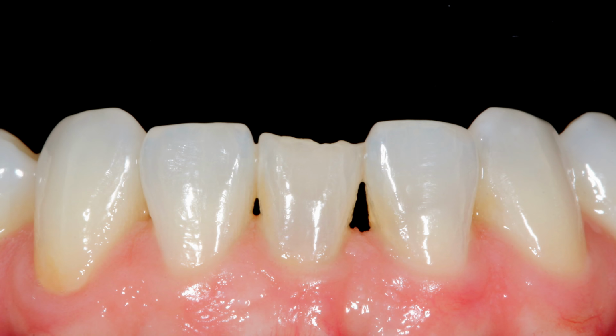This was prior to aligners. So we did aligners on this patient, but we told her we were going to wait until the end of her aligner treatment to fix this tooth so she wouldn't just chip it off. That way we can make sure everything is nice and even and symmetrical. She had ortho when she was younger, and you could see she's missing one of her central incisors. Now that we have her all lined up correctly and the teeth look good, we want to fix this tooth so that she has the great smile that she wants.